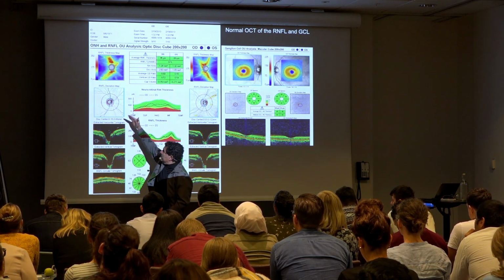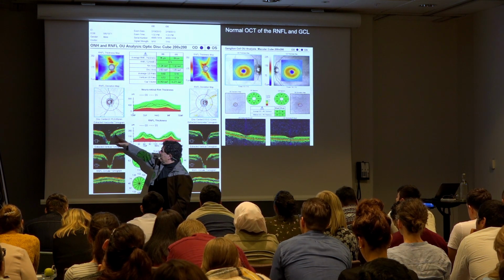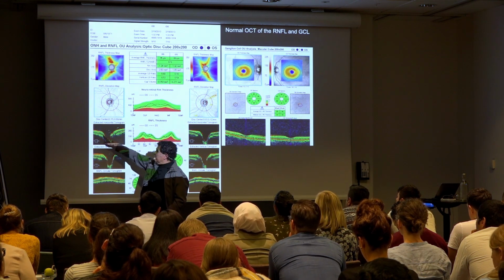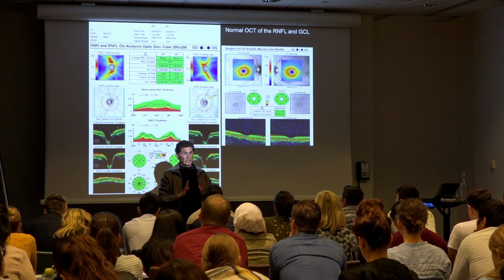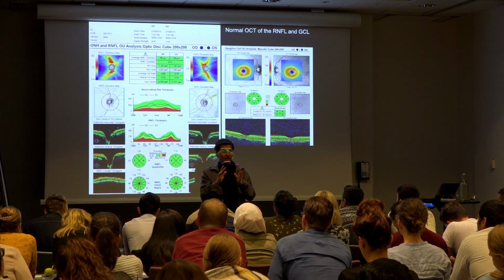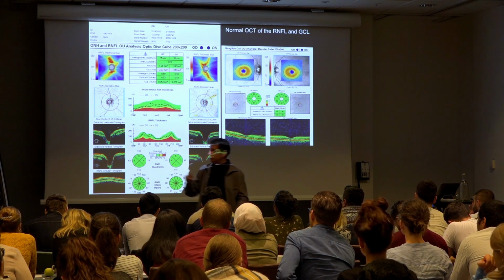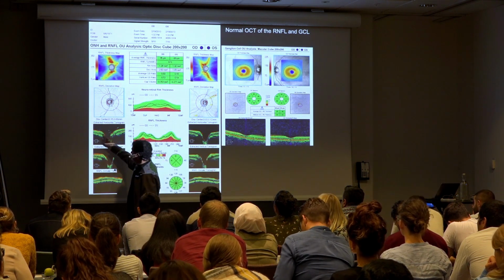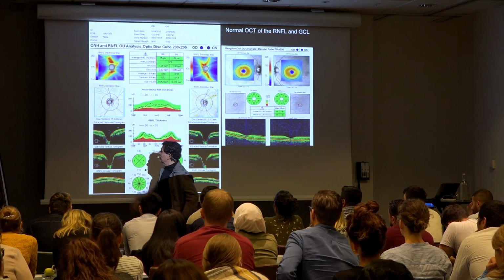In the B scans going through the optic nerve, the algorithm finds where Bruch's membrane ends. And that defines the neural canal opening, where the axons are coming through. So histologically and on OCT, that's the way all manufacturers find the disc area. It's where Bruch's membrane is ending. So you have to make sure the algorithm has done it correctly, and it looks like it has.